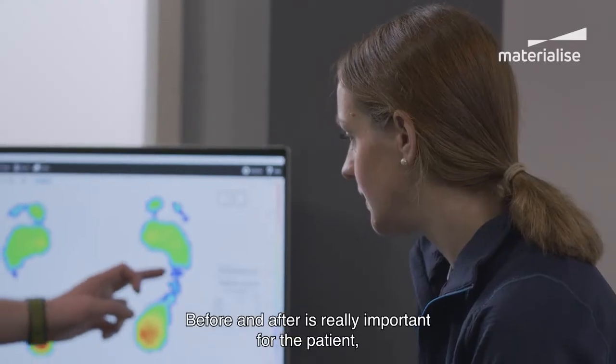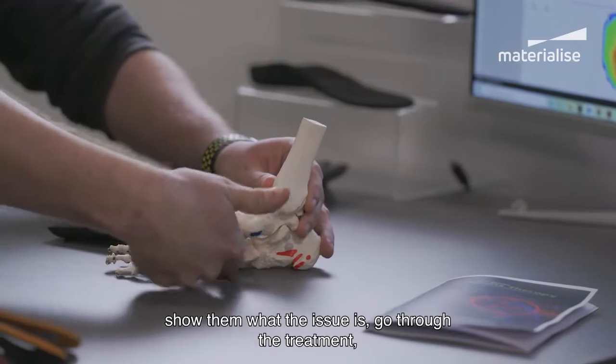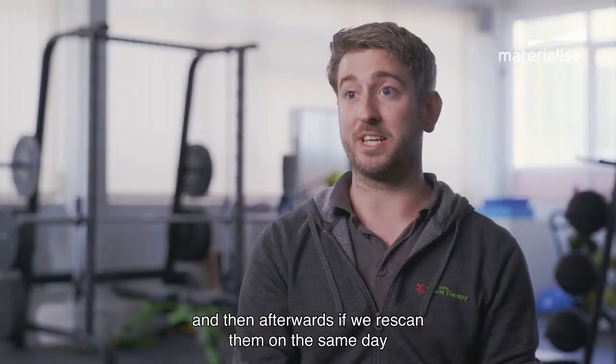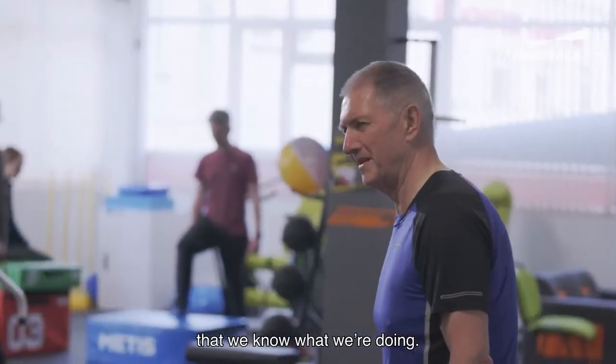Before and after is really important for the patient — it's a really good visual. When they first come in we can show them the analysis, show them what the issue is, go through the treatment, and then afterwards if we re-scan them on the same day they can see the big impact that the treatment's had on them. That gives the patient trust in us and what we're doing.